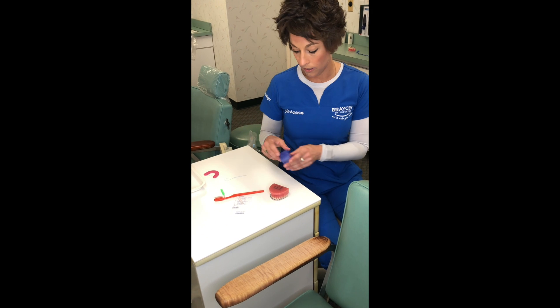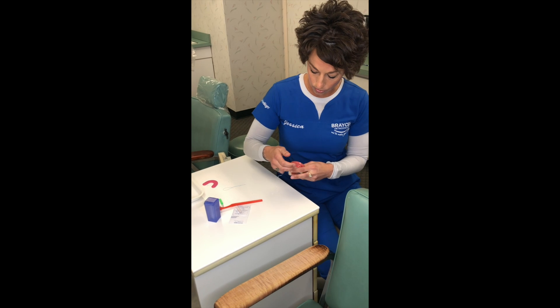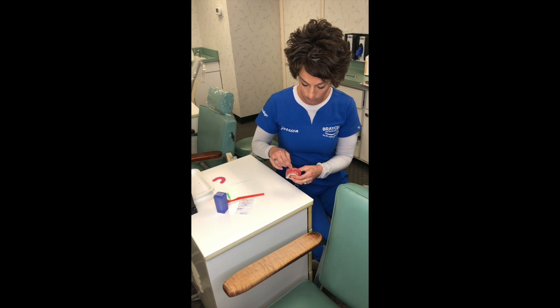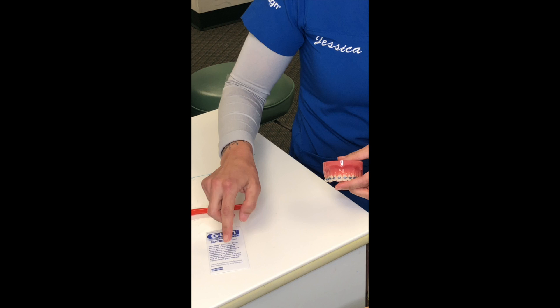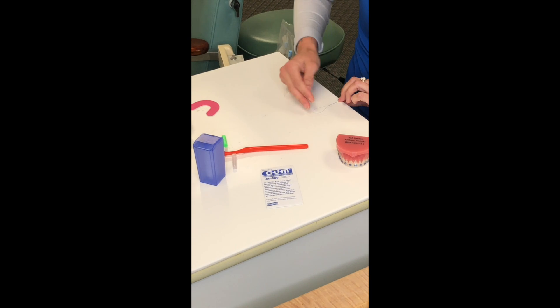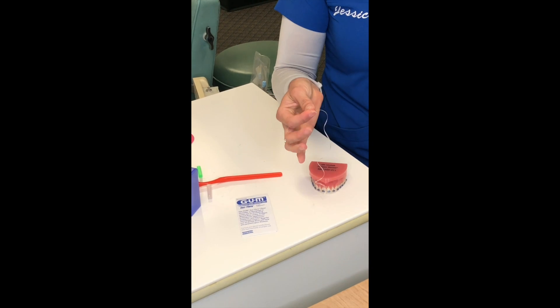It's important to do this three times a day. Now, flossing with braces is a little more complicated. If you have regular floss at home, you'll notice that if you try to floss like normal, you're going to hit the wire and not get to your gums. So we give you a little packet that looks like this, and in there are a bunch of floss threaders.